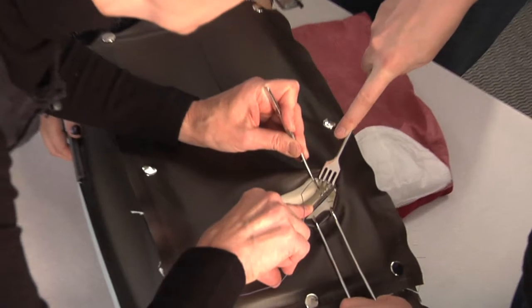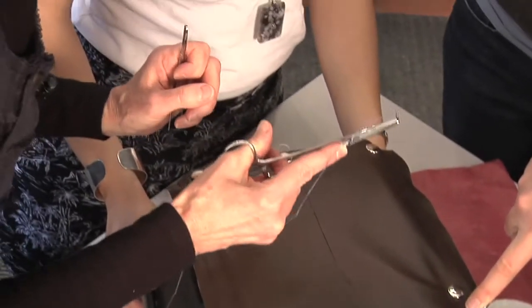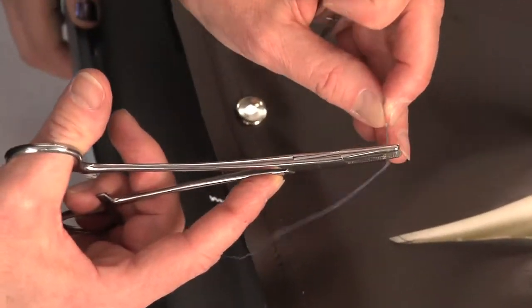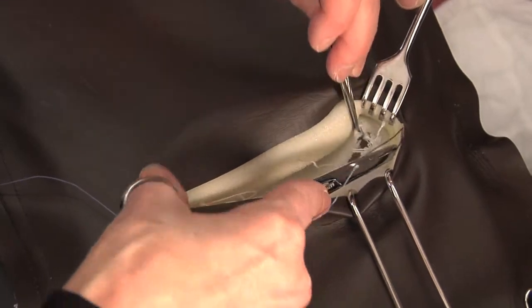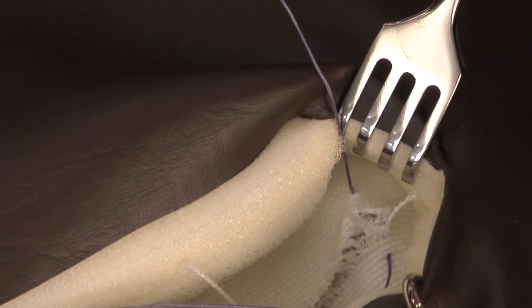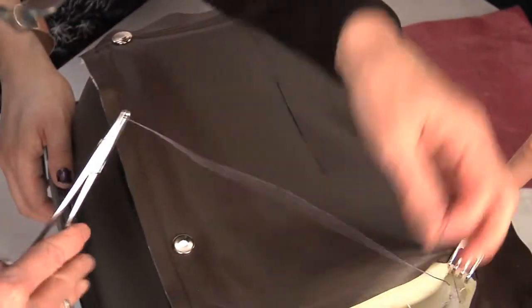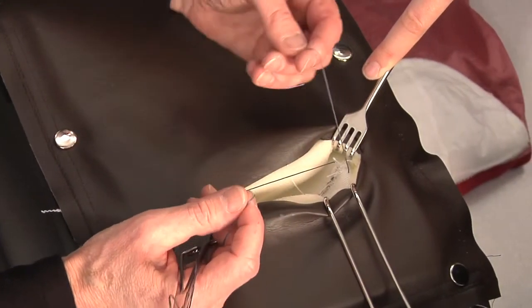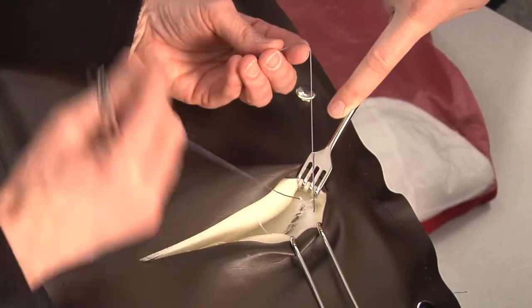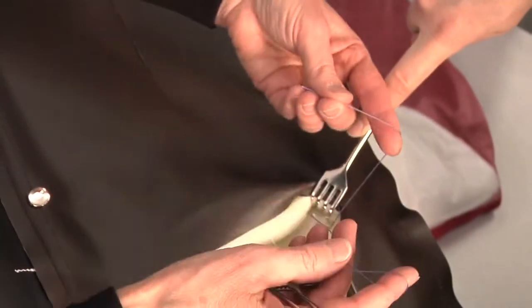So you start over in the corner — same thing as before. Make sure the needle's on the right spot, not too far into the jaws. Start over in the corner. Now I'm going to tie a knot and protect my needle. With better technique and a lighter forcep I could avoid poking myself with the needle. Now we're ready for that one-handed tie. I used to tie a knot the way my grandmother taught me, but I find it hard to tie that way now — the surgeon's habit is so strong. I'll do it slowly for you.